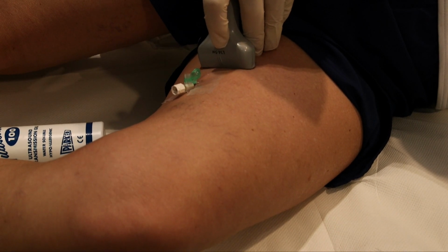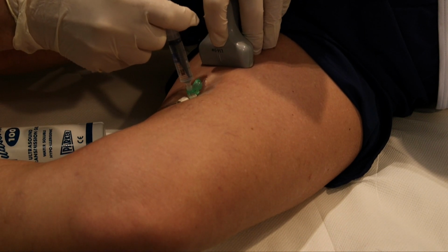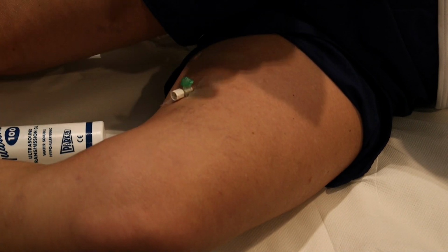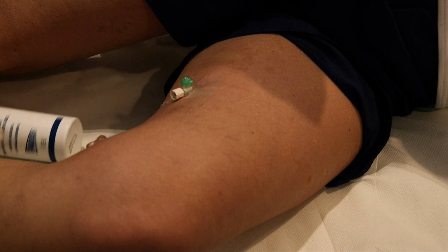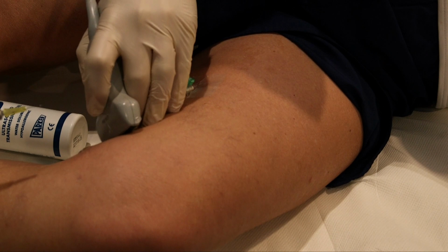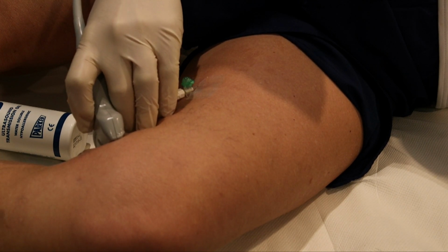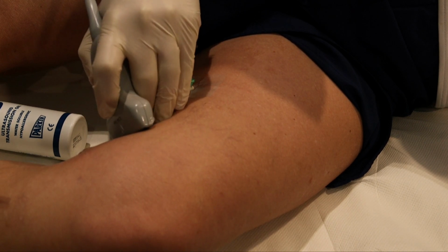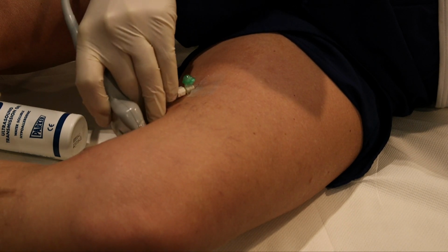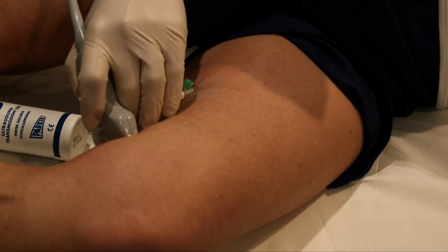Right, so now we have the cannula inside the vein. We can see that on the ultrasound image, and if I squirt some saline in there, we can see that the saline goes in the vein and not anywhere else. So now I want to come down here a little. Here we can see the saphenous trunk inside the saphenous compartment in the middle of the vein, and then there's an accessory vein up there, and another accessory vein behind us. My experience is that we actually have to inject all of those to get a satisfactory outcome.